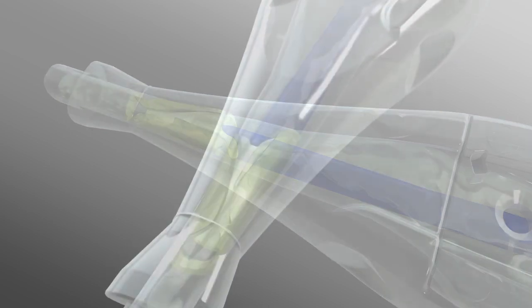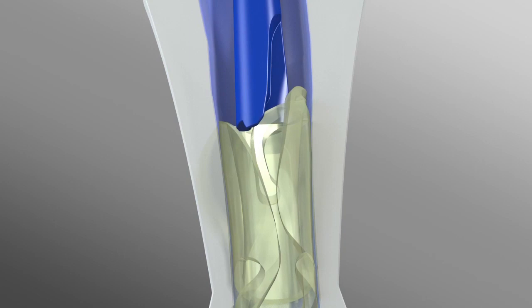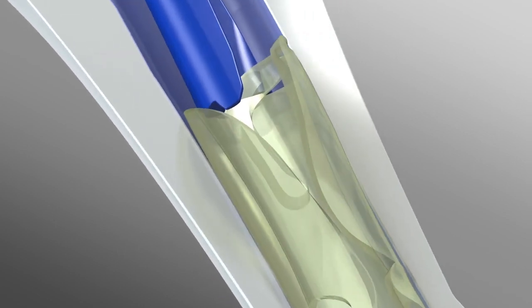It is important to not advance the plunger abruptly, as improper folding and lens damage may occur. At this point, check the plunger position under the microscope.